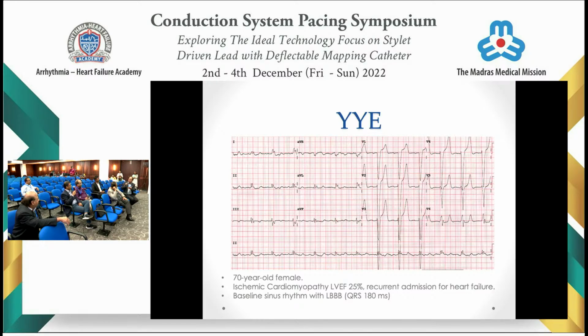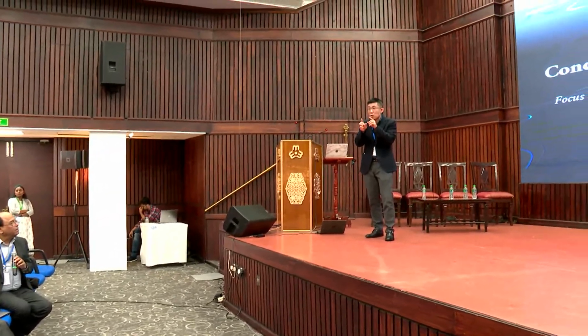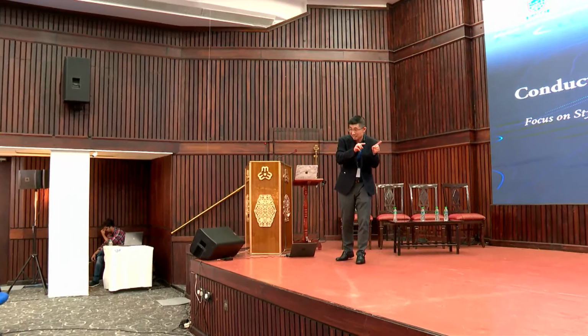So we have to see the context in which the pacing is happening. I think we're jumping a little bit. When you say correct the right bundle, did you actually also correct the left bundle in the process? Right, that's the million-dollar question. Vice versa as well. If you correct the left bundle, you potentially can correct the right bundle to a certain extent.